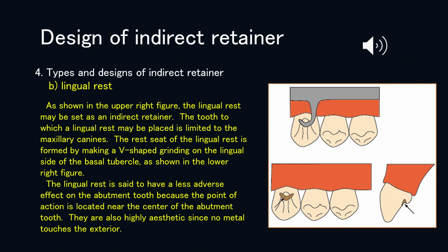Four. Types and designs of indirect retainer. B. Lingual rest. As shown in the upper right figure, the lingual rest may be set as an indirect retainer.